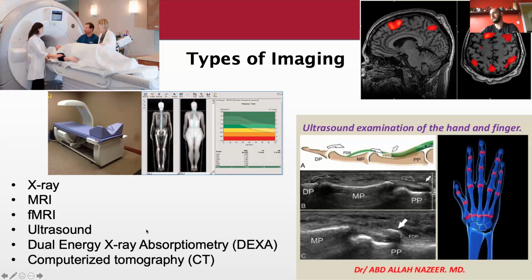DEXA, dual energy X-ray absorptiometry. Here we have an example. You would lay down and get scanned. Very, very similar technology to an X-ray, and it allows us to get an overall image of your bone density.